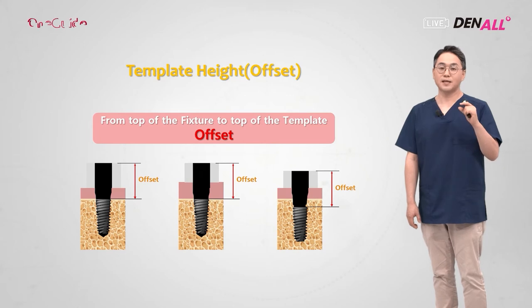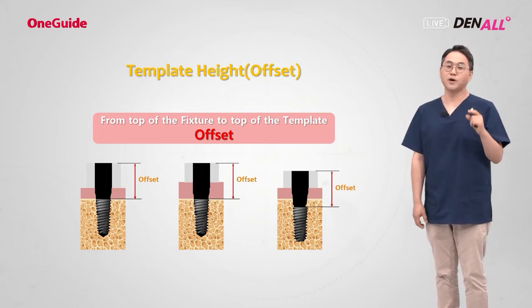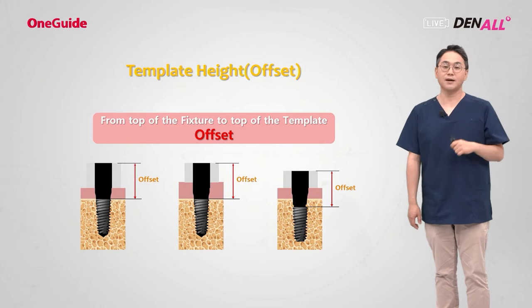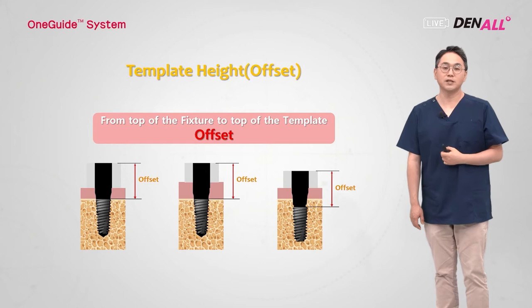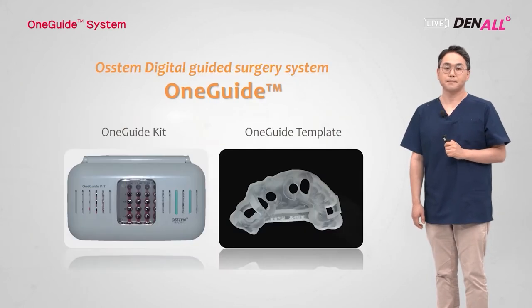In another situation, if you need to place an implant deeper, the amount of subcrestally placed implant plus gingiva thickness and the guide hole thickness is the offset value. Once again, offset is from the top of the implant to the top of the guide hole made. Based on the offset, by controlling the guide hole thickness, the vertical apical-coronal positioning of an implant can be made.